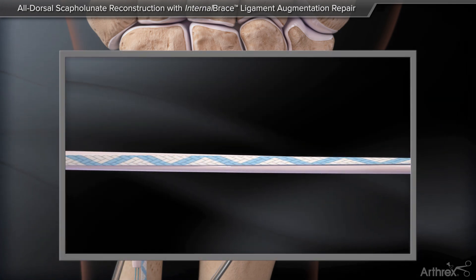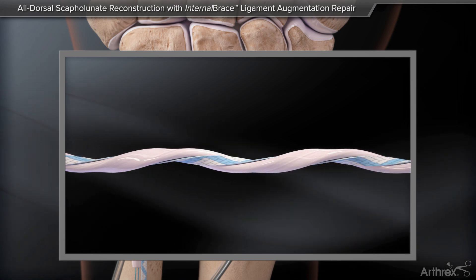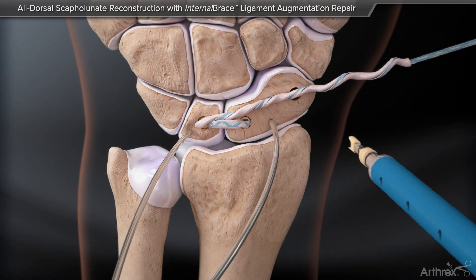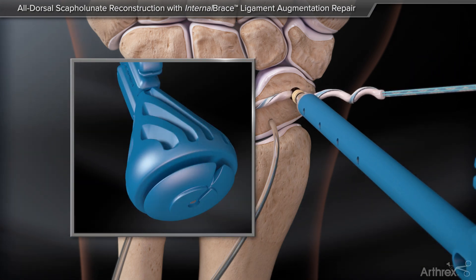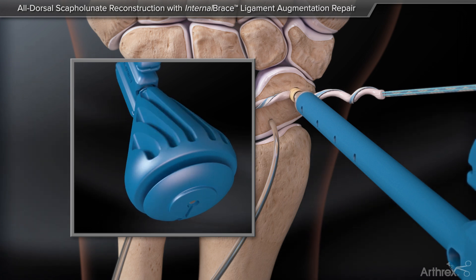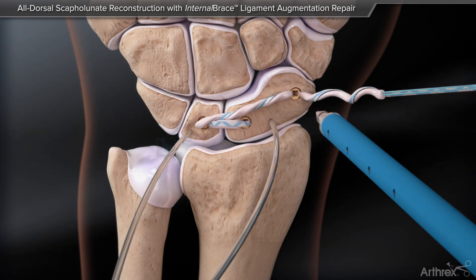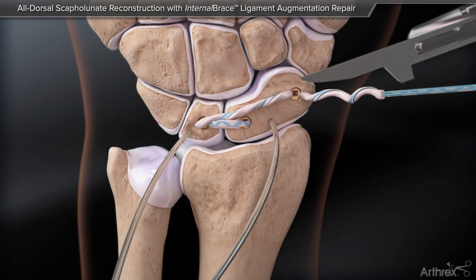The graft and suture tape are twisted together to facilitate insertion into the distal pole. The final swivel lock is inserted into the distal pole of the scaphoid. The remaining graft and suture tape are cut flush.